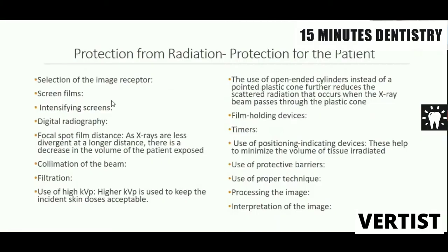So selection of the image receptor, that is the type of film you use, fast films or slow films, film screens, intensifying screens, whether you want to use digital radiography or conventional radiography, focus spot distance, collimation of the beam, filtration of the beam.